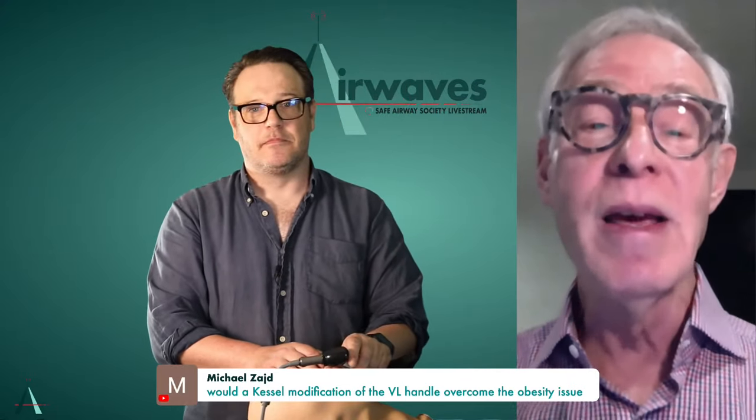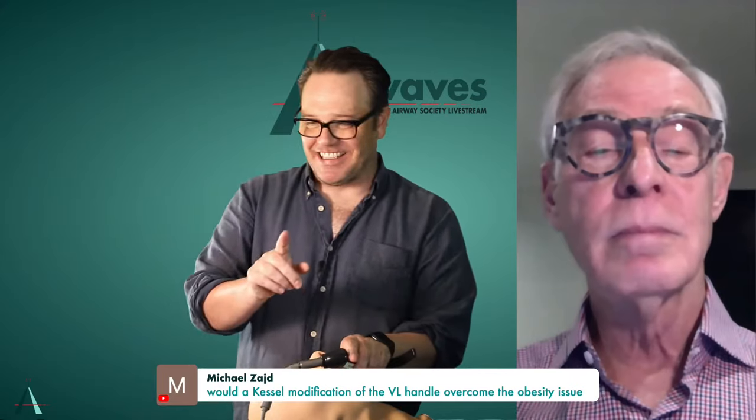The study has been done. It was a non-equivalence study done by Michael Aziz and colleagues. They found that the two blades were not equivalent, but the difference between them was not all that important. It actually did favor the GlideScope over the C-MAC, even though it was a study funded by Storz. Michael Aziz was a consultant who trained me when I was a registrar many years ago, and has offered me some pearls that I still practice to this day.